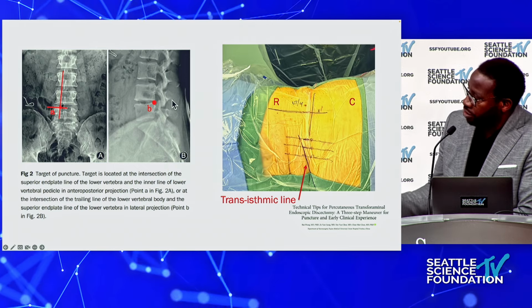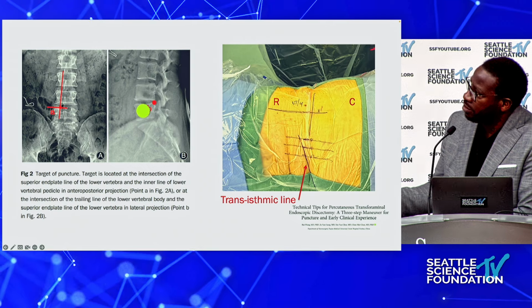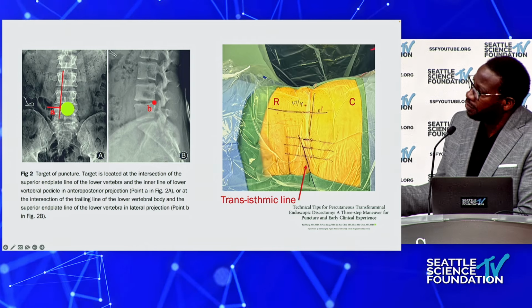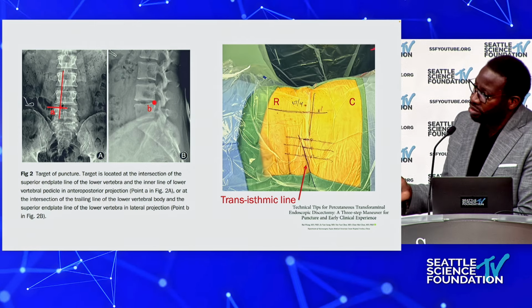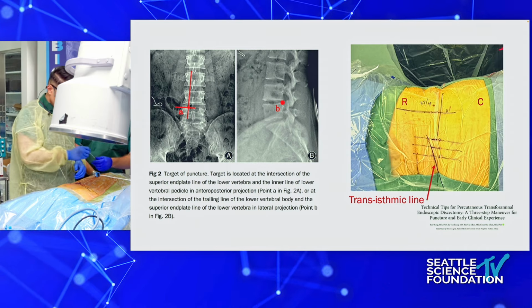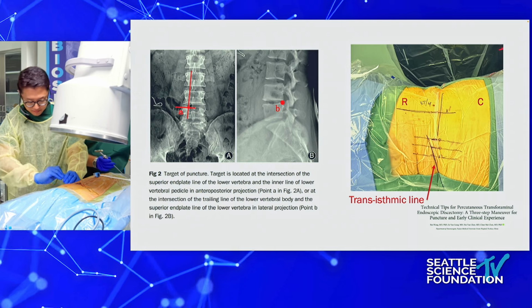What you can see here on the monitor, what Meng just accomplished in this scoliotic specimen, was he landed his spinal needle here on this posterior vertebral body line. On the AP, he has his spinal needle right here on this mid-pedicular line, which is what we're targeting. Initially, he was trying a trans-SAP approach, which proved to be a little bit difficult because, one, the foramen was pretty large, and two, the angle and rotation of this cadaver didn't give us a really good picture. Despite best efforts to get a true lateral and true AP, it gave us a little bit of a starting point.